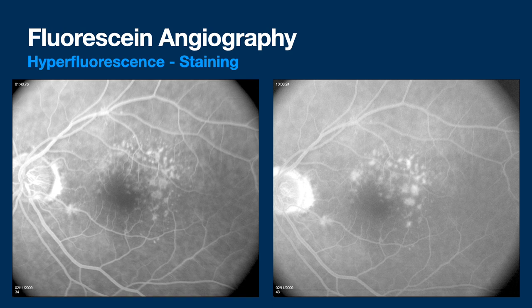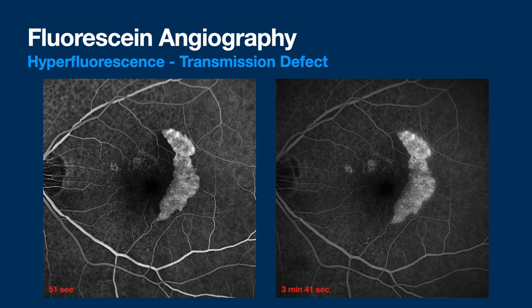Here's a staining example — these are drusen. Staining means brightness in an area that maintains its boundaries over time; it's generally thought to happen to solid tissue. Next, a transmission defect: this lady had a spontaneous RPE rip. Temporal to her fovea you see this bright white dash — that's where the RPE got pulled back, exposing the underlying choroidal fluorescence. It's like someone opened the curtain — the RPE is no longer blocking it. This is a good illustration of what we mean when we say the RPE acts like a curtain.